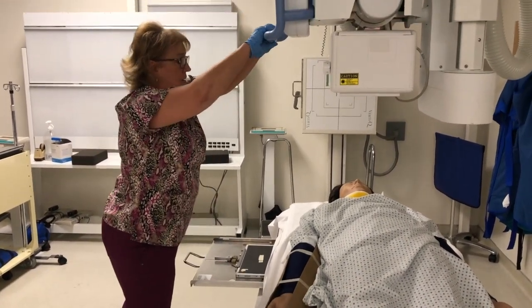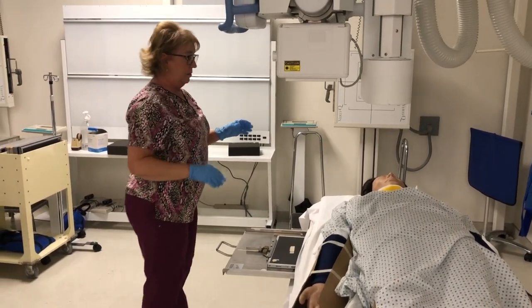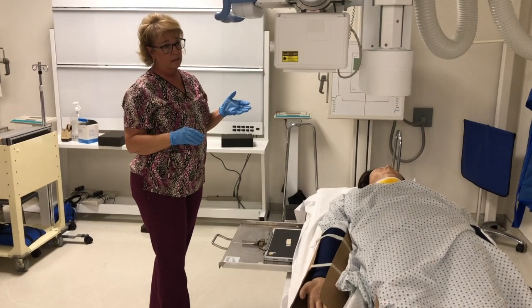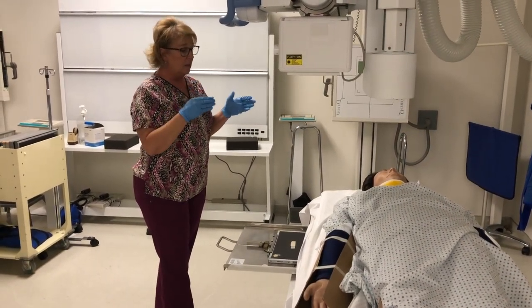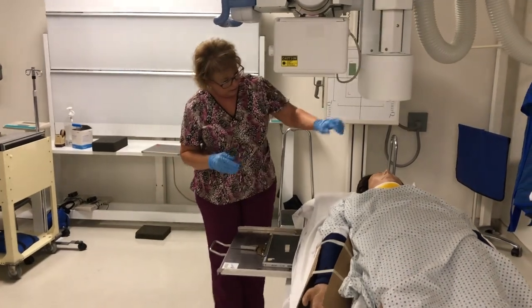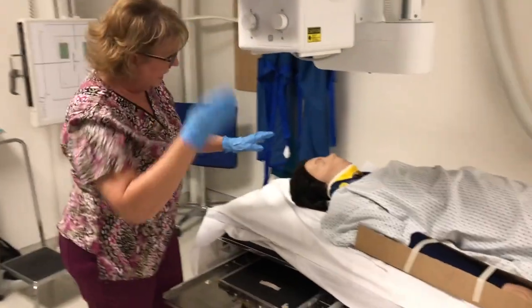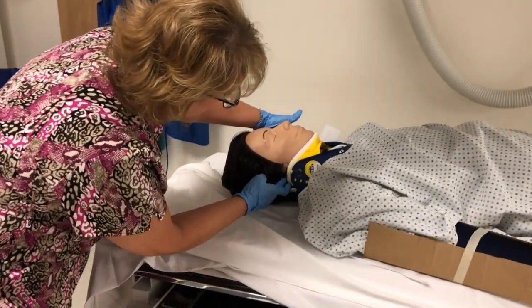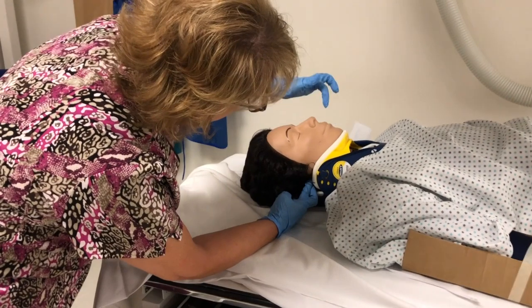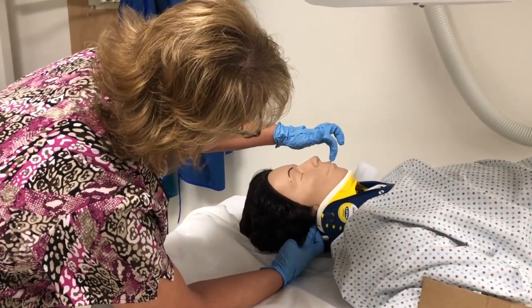And this time, because I cannot adjust or tuck or extend the chin, I would be looking at where the mastoid tip is, and she could open her mouth. I could see where her teeth are.